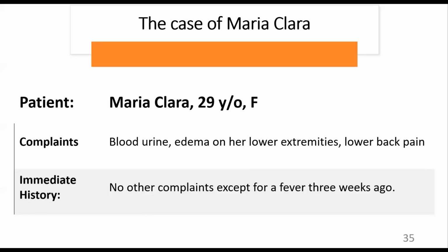And then when we performed the semi-quantitative test, yung third na circle sa slide ang nag-yield ng positive reaction. And the third circle has 1 is to 8 dilution. And after computation, we yielded a 1,600 titer for Maria Clara.